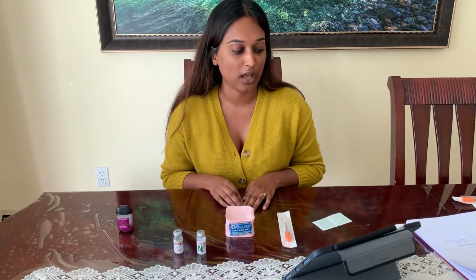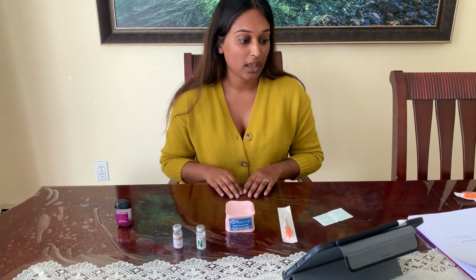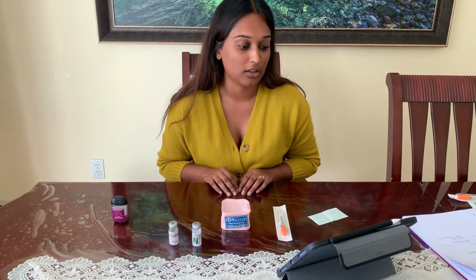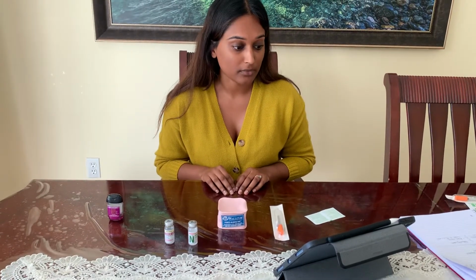So doing all those checks, saying everything's okay, we proceed on to the scenario, and it specifies that I'm caring for a patient who's admitted with uncontrolled type 2 diabetes. They require Novolin NPH, AM and at dinner, and Humalog Lispro QID as per sliding scale. The morning glucometer reading was 10.6.